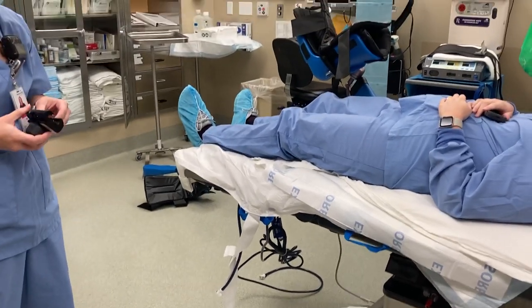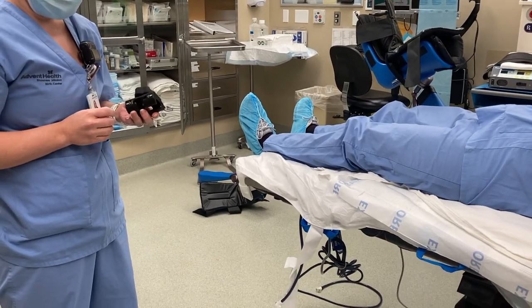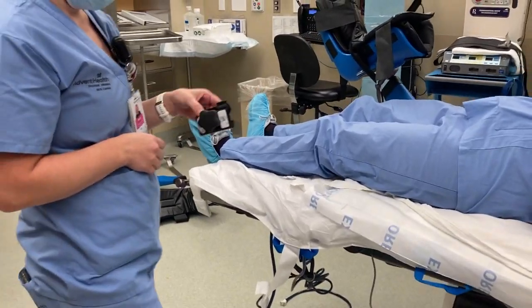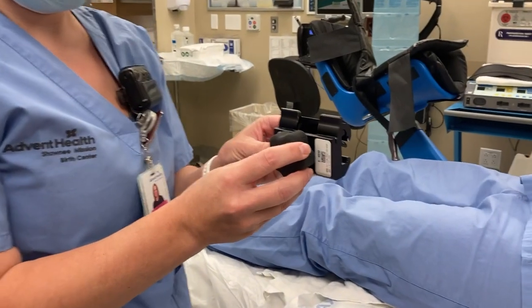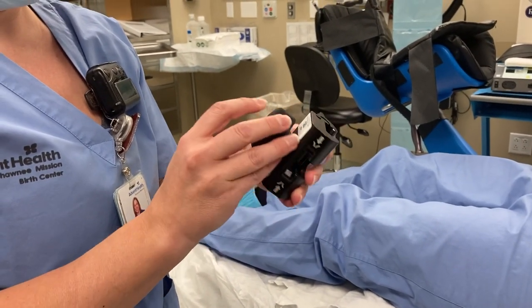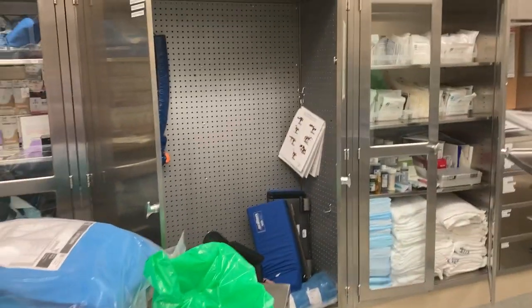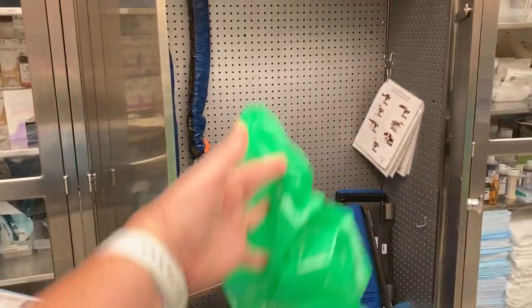This is a video of how to attach the Allen stirrups to the bed. Kelly's going to show us. These are the black brackets to hook the stirrups onto the bed. They are found in this cabinet right here in the green bag.